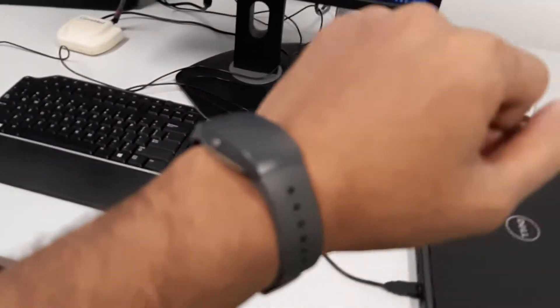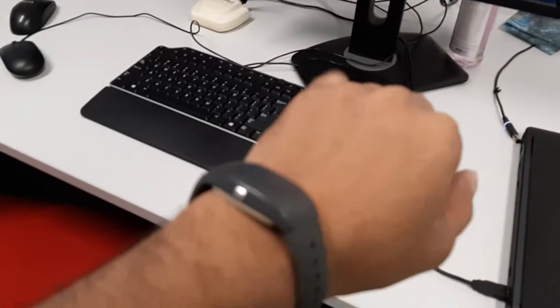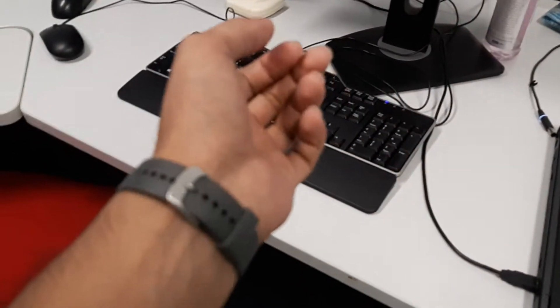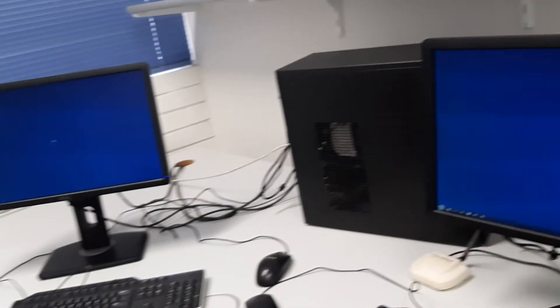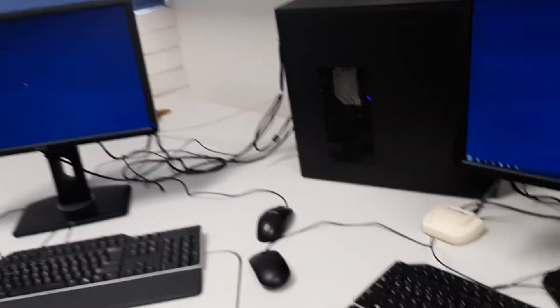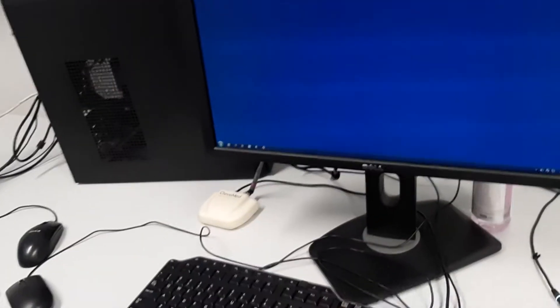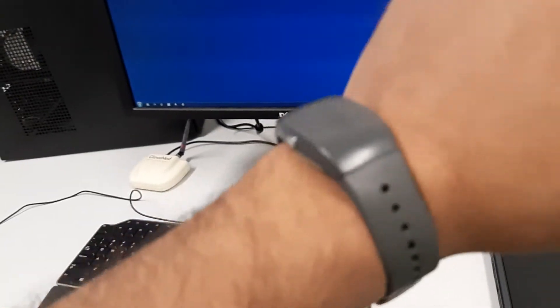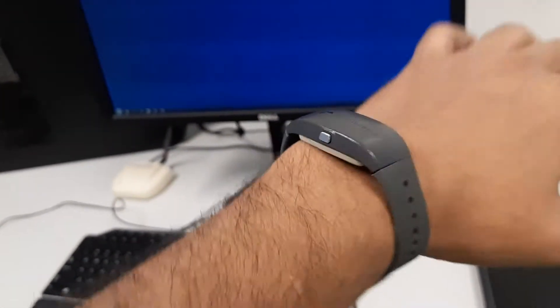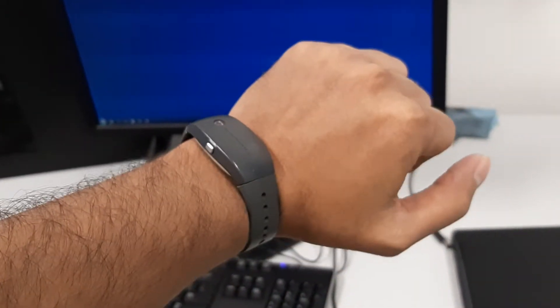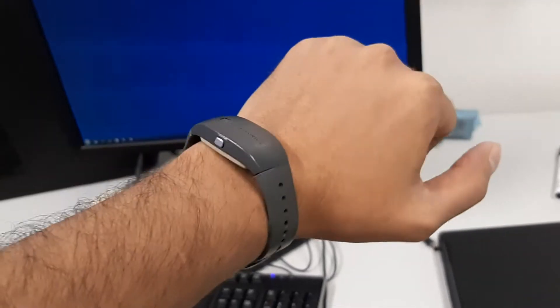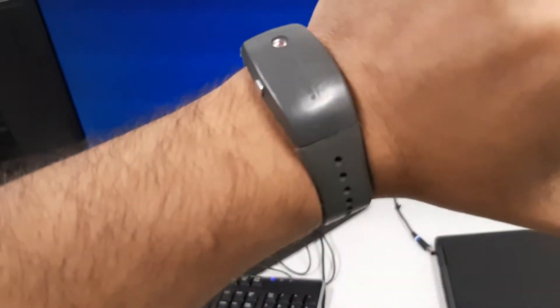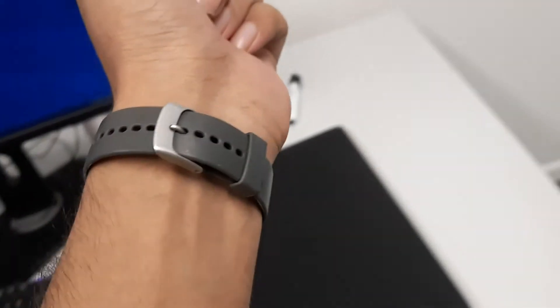Hi guys, today I'm going to show you how to check the Actigraph data in the lab using software and the Actigraph watch. Here you can see that I have this Philips Actigraph watch. I have worn this Actigraph watch for two days and two nights.